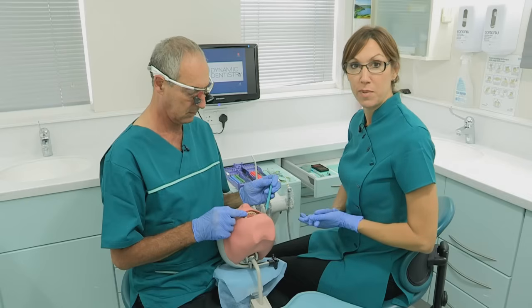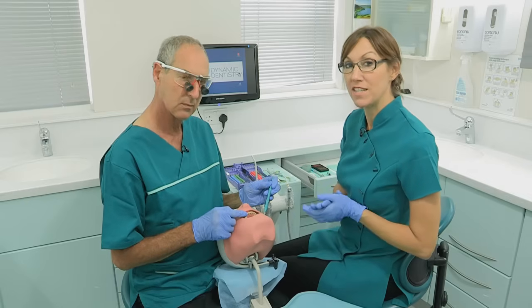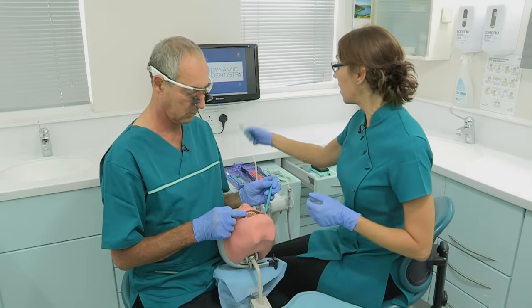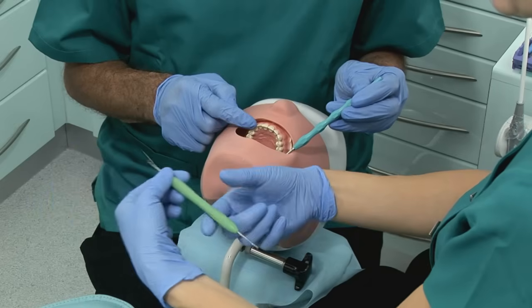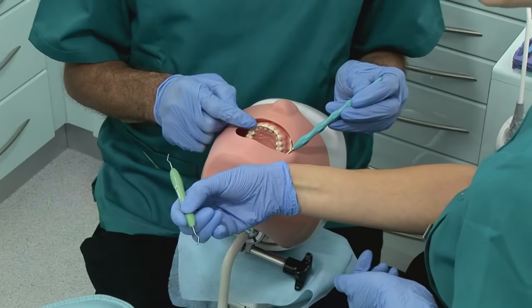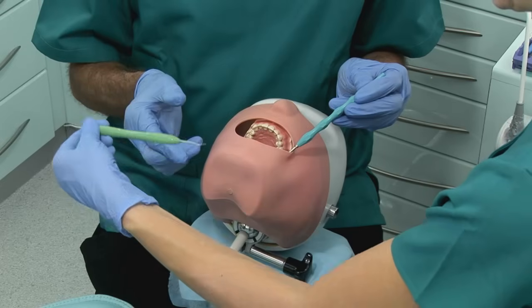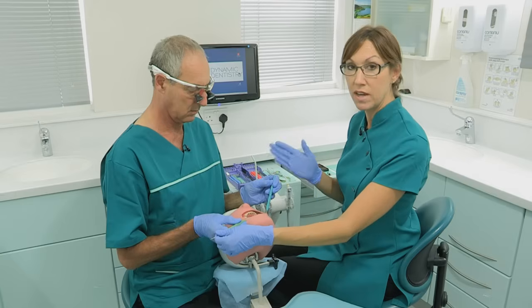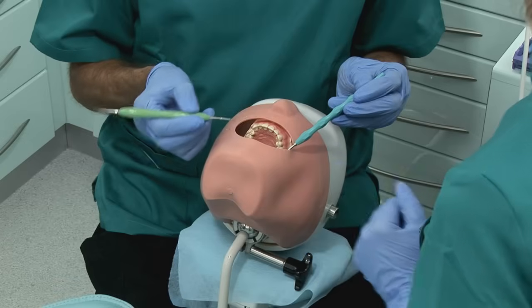There are lots of different ways of passing instruments, and you'll develop your own way between you and your dentist. But this method seems to work with all of the instruments we pass. I will pick the instrument up. I'm using the non-working end. I know Martyn wants to hold the instrument in a pen-like grip, so I don't want to hold the instrument in that place. So I'm going to grip the instrument at the end, but very firmly, because I need to be able to place that into his hand without him looking up. And that's very crucial, that you're very firm with the placement of it.